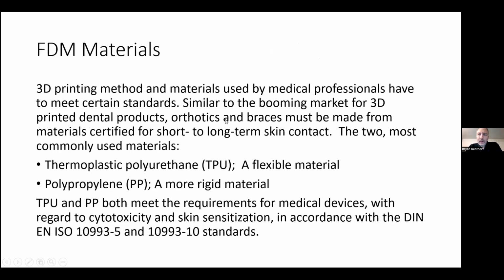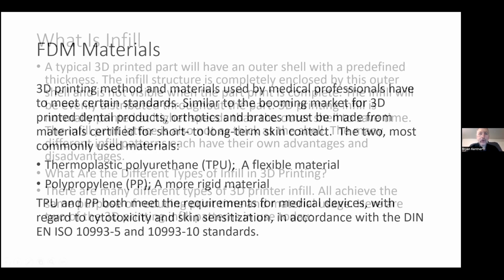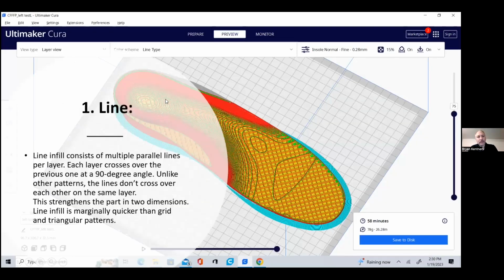So next, we're going to look at materials. And again, the materials that I recommend really are only going to be two right now for producing orthotics at your office. TPU is going to be your standard material that's very flexible. You can change the durometer, so you can have your diabetic insoles, although right now you're not covered medically for diabetic insoles that are 3D printed.